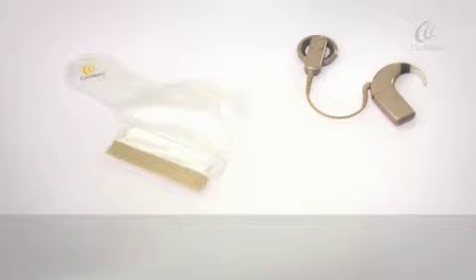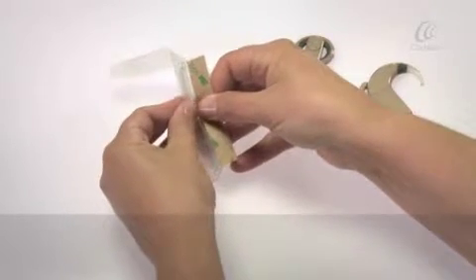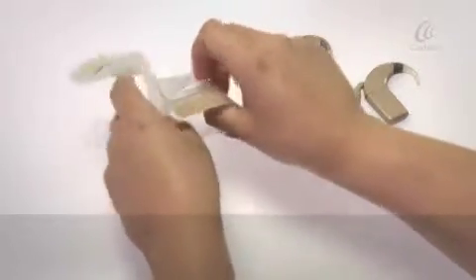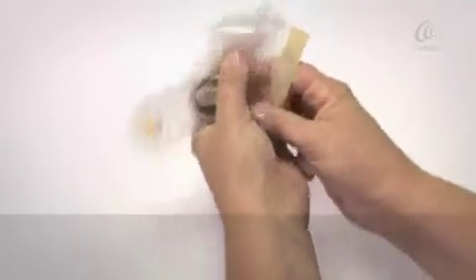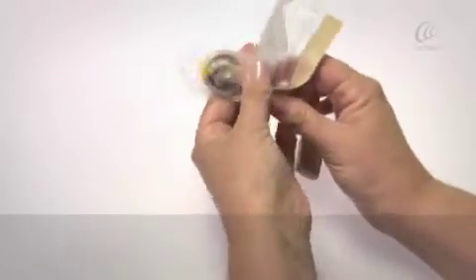To insert your sound processor into the Aqua Accessory, separate the seal and open the Aqua Accessory. Check that you are inserting the coil in the correct way for your left or right side. Insert the coil followed by the processor into the Aqua Accessory.